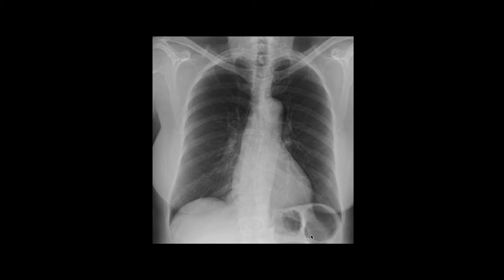Here's an example of a normal chest X-ray. I tend to start looking at the devices — this patient doesn't have any — and then I look at the lungs. One of your best friends when looking at the lungs is symmetry. The lungs are not exactly symmetric, but generally on the X-ray you can just see that the lungs should be equally clear from side to side. I often try to scan them from side to side to look for any nodules, airspace disease, or other asymmetric findings.